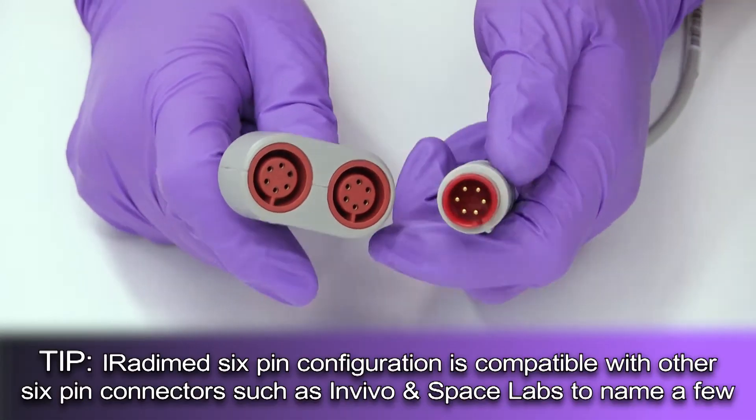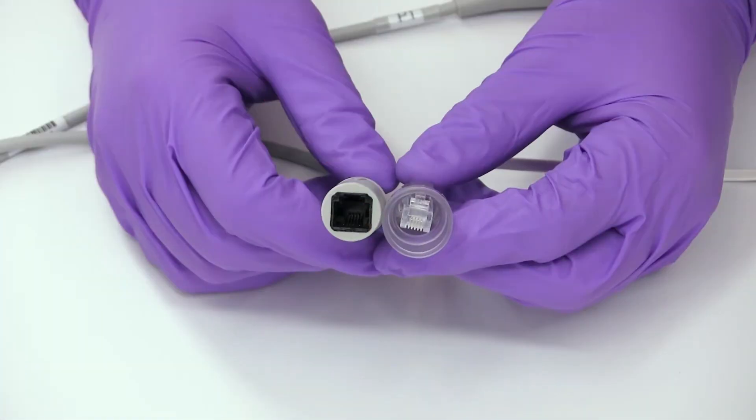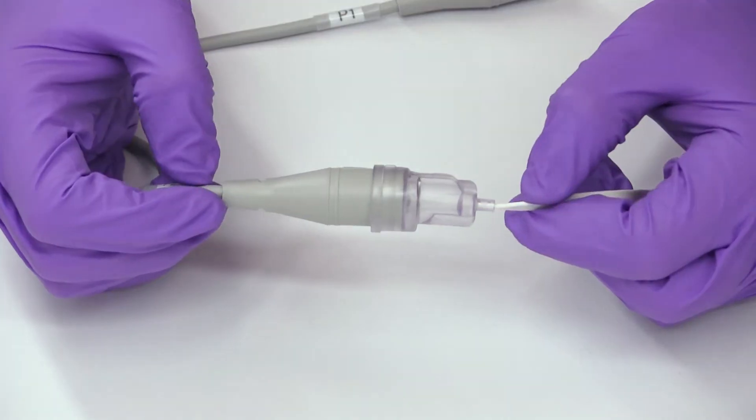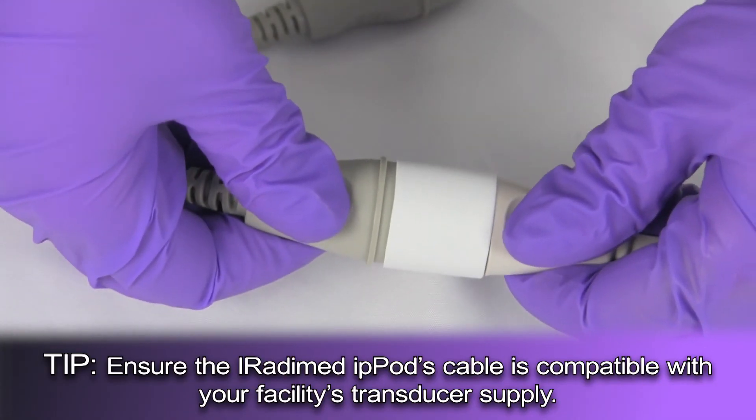To connect the transducer components, the user will grip the IBP pod's connector in one hand and the transducer's connector in the other. The user will insert the transducer's connector into the IBP pod's connector that matches the label and push until a snug fit is established.